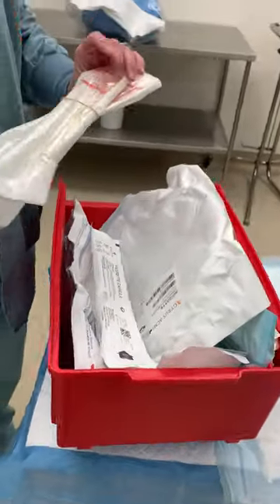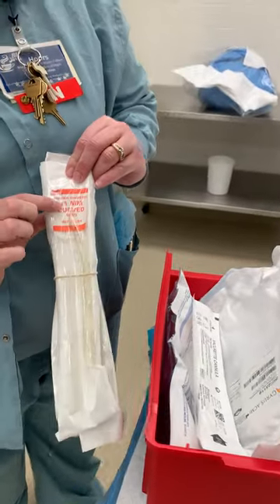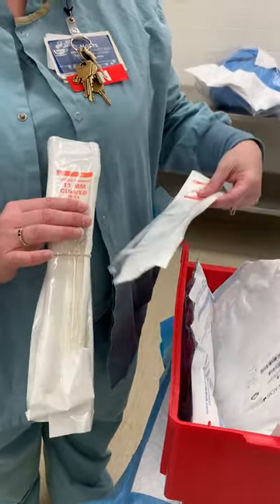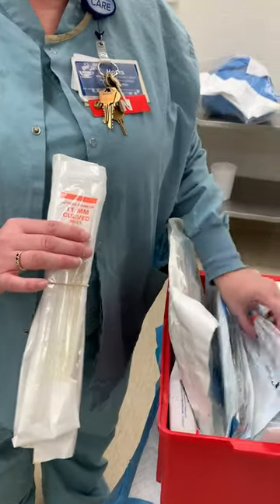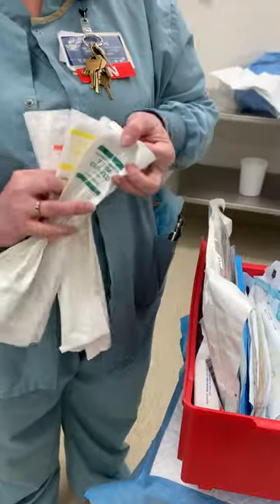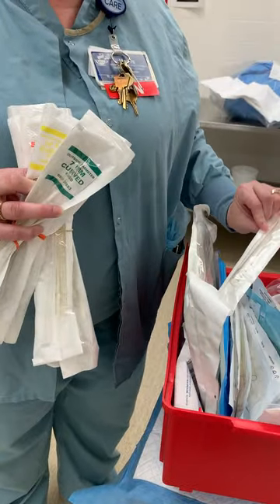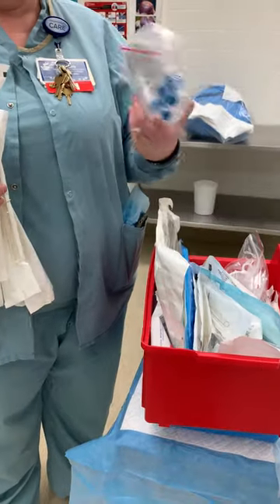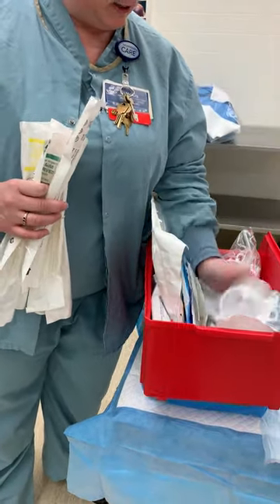There are different sizes, so the physician will tell you what size they want. This is how you know the size — there's a 12, a 7, a 14, and all kinds of different sizes. There are also more supplies to restock if you need them in here.